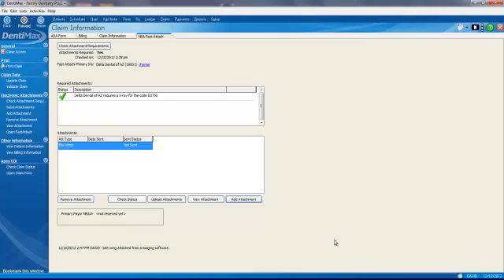And now we can go ahead and send this electronically to the insurance company, saving us a ton of time and getting paid. So wonderful feature, and it's going to get you paid a lot faster.